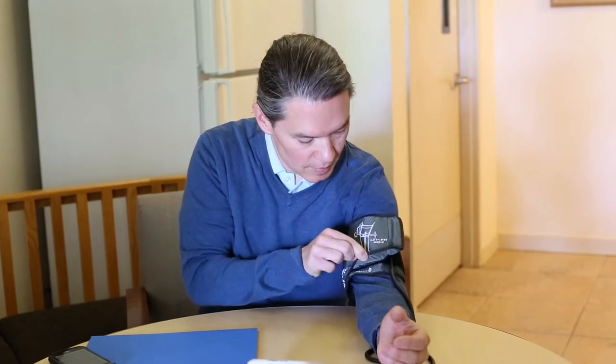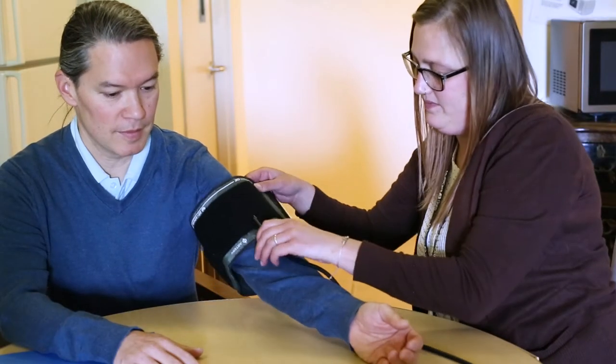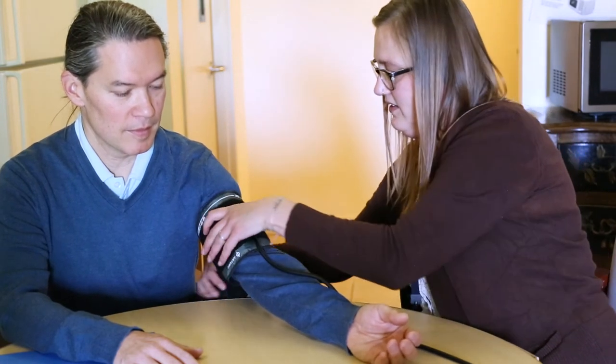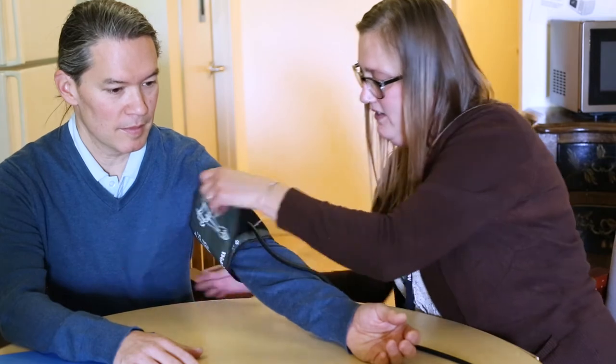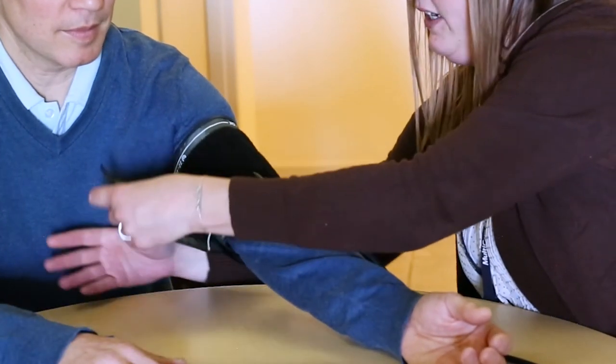The blood pressure cuff you receive is battery operated and does not need to be plugged into the wall. The cuff will need to be fitted to your arm. Please have a family member assist you with this part. The cuff should be placed on the arm with the tubing facing away from the patient, or traveling down your arm.